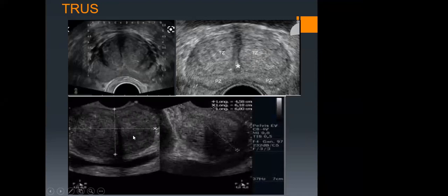So pathology is not static. Pathology is not in the books, but it is how we receive our patients, how we correlate their presentation and their perspective. So do not take it for granted that always you are going to see the transitional zone. That is the predominant feature. But you'll have instances where you have uniform enlargement without distinction of the zones.